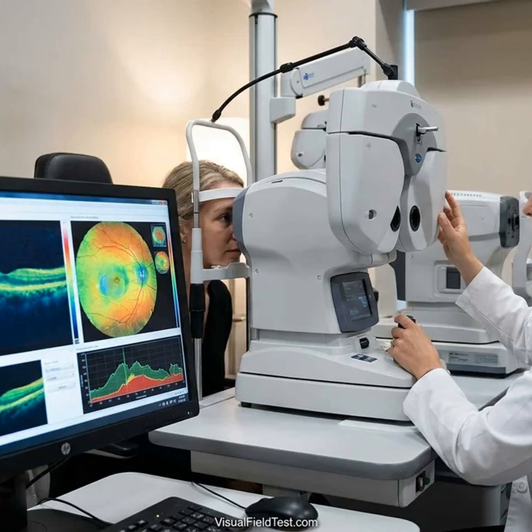Interpreting OCT alongside other tests. It is crucial to remember that OCT is only one test. Glaucoma decisions are never made on OCT scans alone. Rather, an eye specialist will integrate OCT findings with visual field tests. These provide the functional perspective, what you can see. If both OCT and the field show corresponding damage, for instance, a region of thinning on OCT lines up with a field defect, the doctor can be more confident.